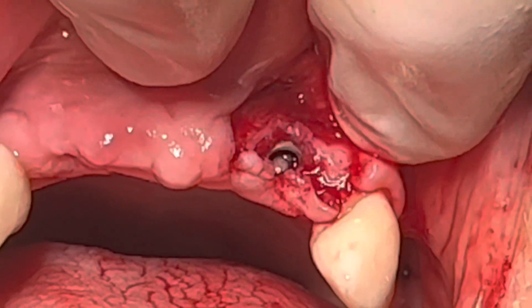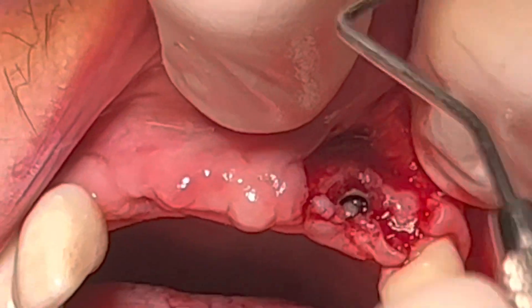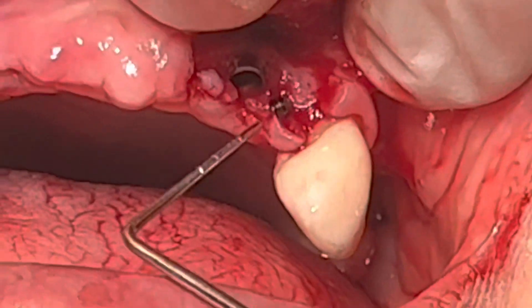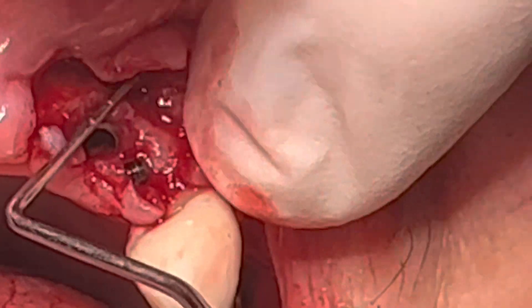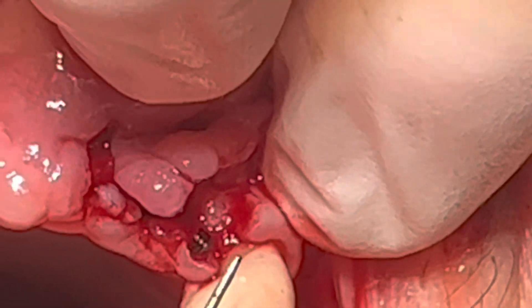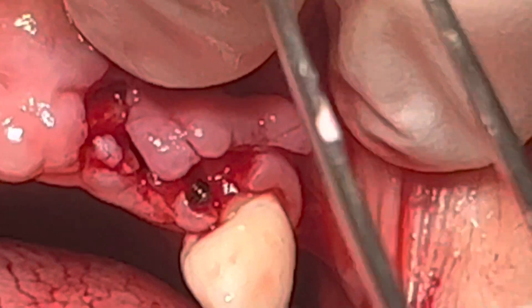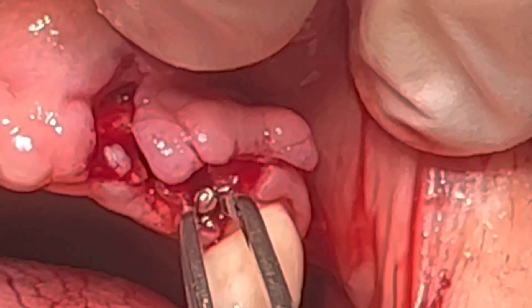We rotate it counterclockwise and take that little piece out — there it is. Let's get the camera a little closer — there's the piece. Now we're going to take that little piece and just remove it. We want to take a picture of it, of course, and then we'll put the patient back together. Not really a big deal — it took less than 20 minutes to solve the problem, but that is a small piece of the screw.